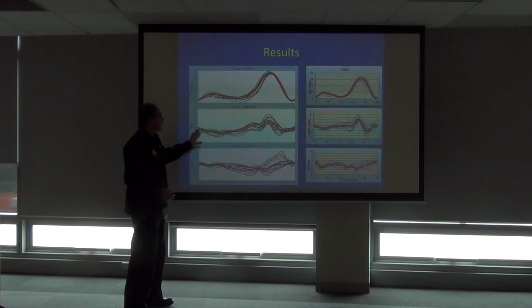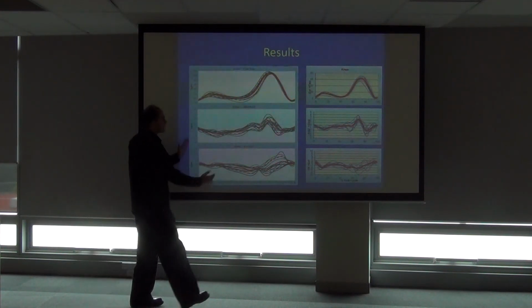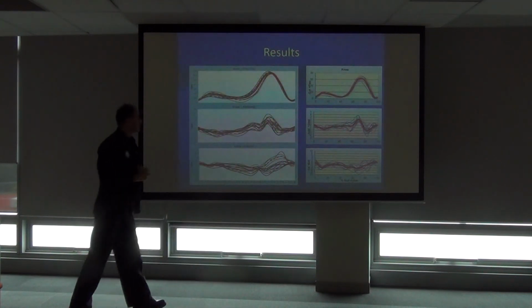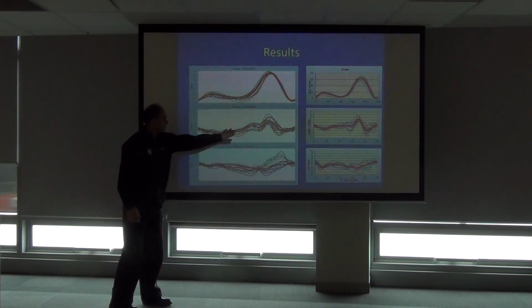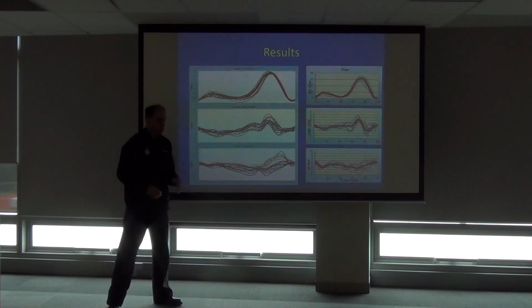The least variable was this one, the knee abduction adduction, even though you can see that there are differences between the stance phase and the swing phase. And if you just look at the swing phase, we almost look at identical, or very similar, but not identical, but similar gait patterns. Here we're looking different, here we're looking similar.